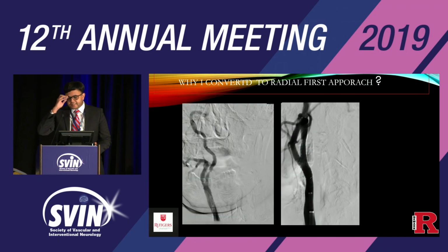This is the case from when I joined last year as attending. This is my second week of attendingship. The lab is not set up for femoral. This is radial cases. This is a nice case that came in. It's a symptomatic carotid artery. We want to put a stent. Fine. We went femoral. The case went beautifully. We were high-fiving. 15 minutes. Great case.